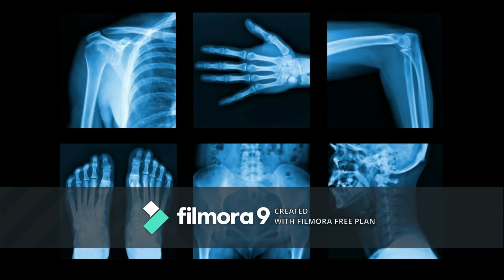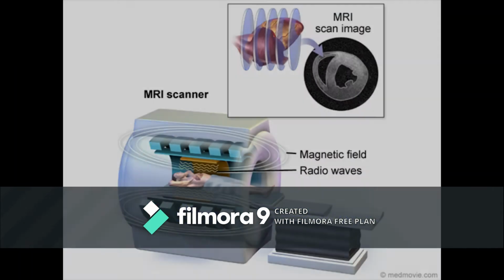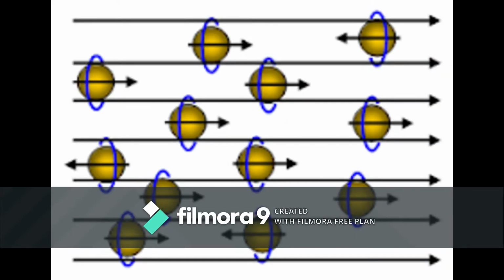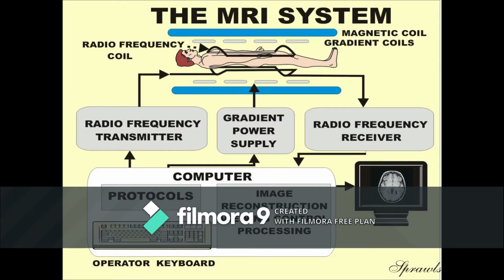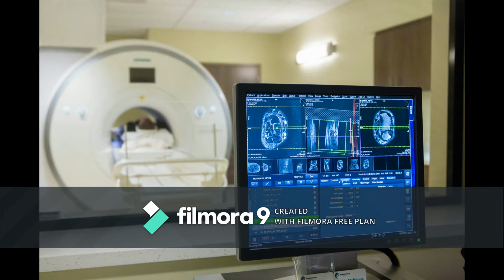Rather than using X-rays, MRIs use strong magnets to create a magnetic field, low-energy radio waves, and a computer to display the scanned images. The magnetic field causes the hydrogen atoms within the body to align in the same direction. Radio waves are then passed through the different parts of the body which are being scanned, forcing the hydrogen atoms to come out of alignment. These atoms then realign once the radio waves have been disabled, and as they do so, they produce radio signals which are transmitted to the radio antenna or receivers. The computer then receives this information and generates images.